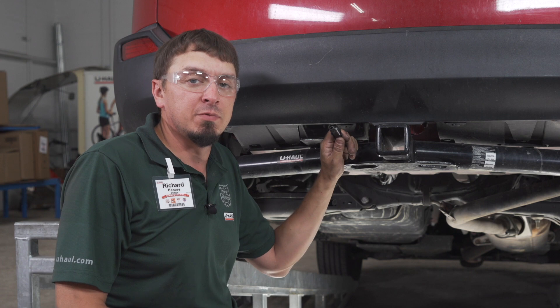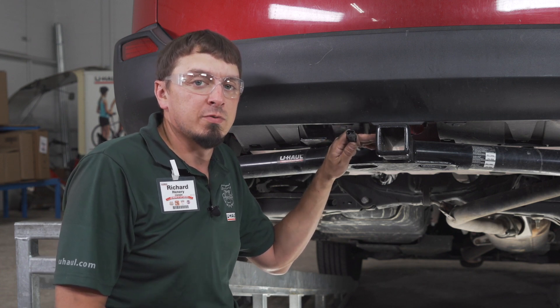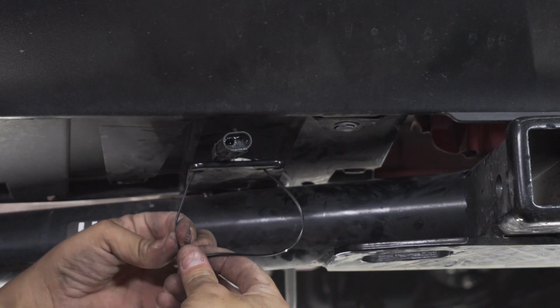Now that we have the wiring to the back of the vehicle, you're going to want to put it near the receiver so it's easily accessible. For storage reasons, you can put this up behind your bumper or you can simply attach it to the hitch.